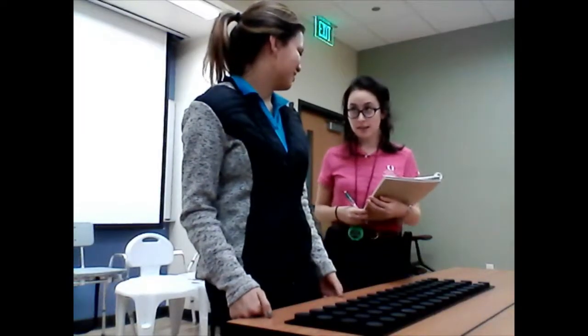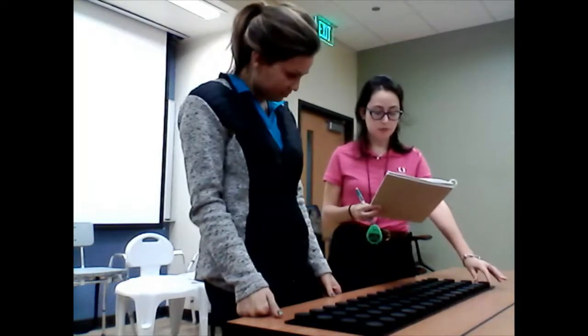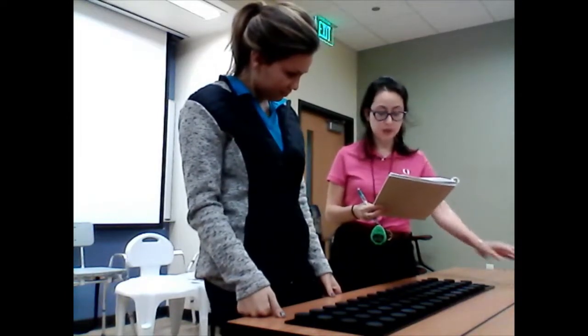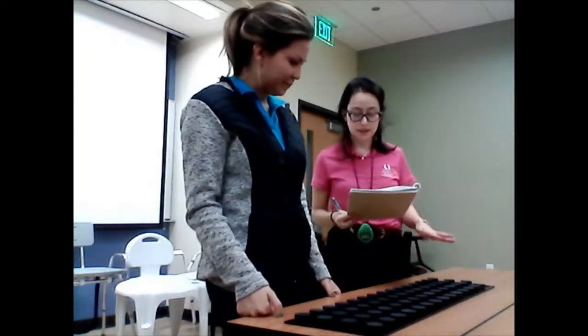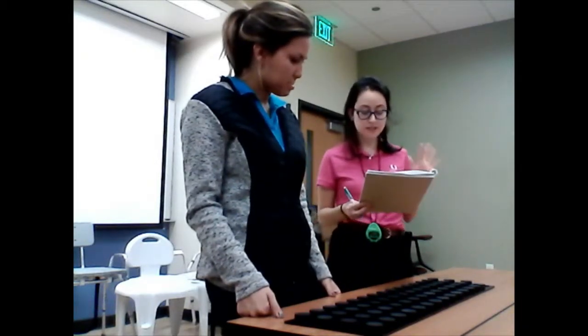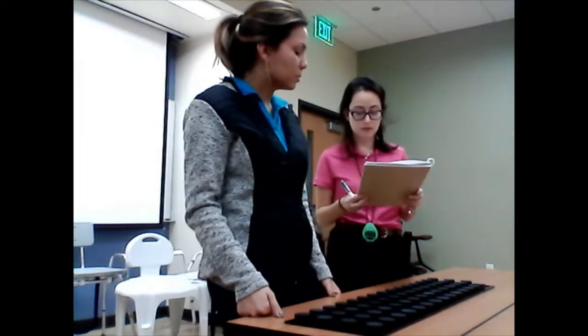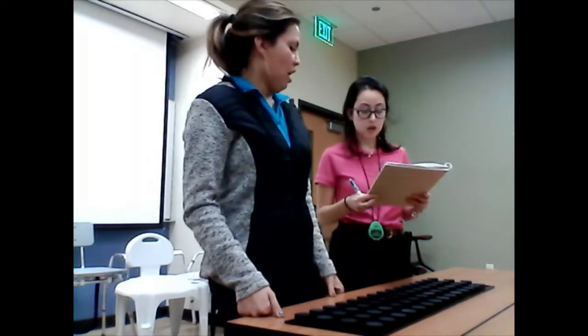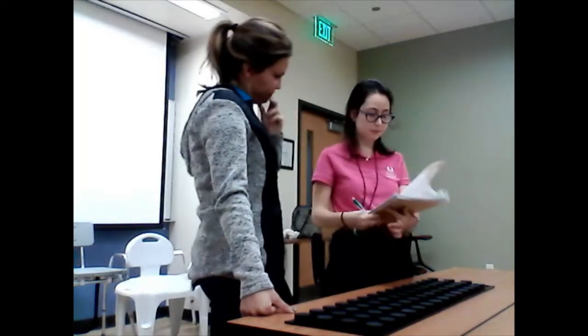We are now doing the displacing test. So we're going to remove the block from the upper left corner and put it to one side. This is the starting position for the test. The object of this test is to see how fast you can move the blocks one at a time from one hole to another. Use whichever hand you prefer. You will do it like this.